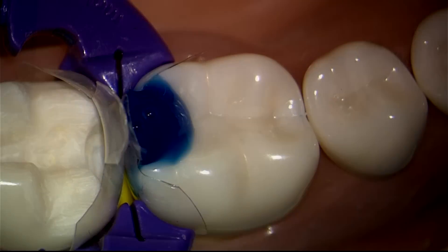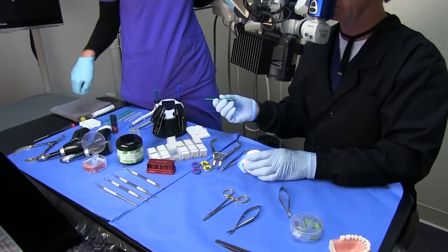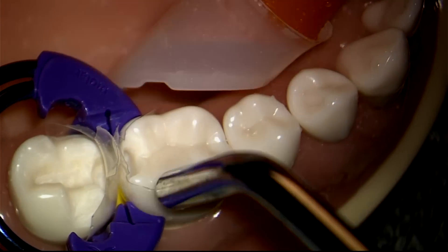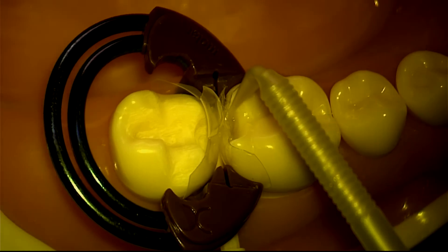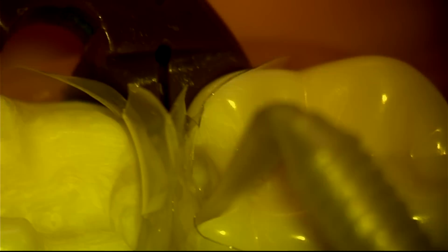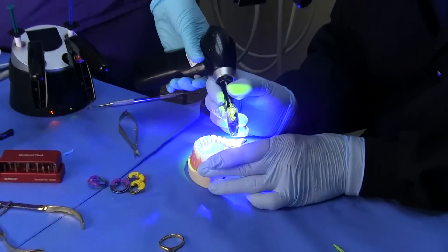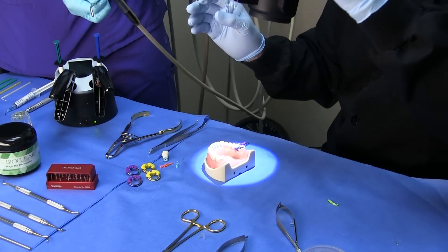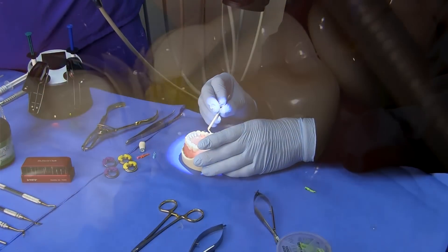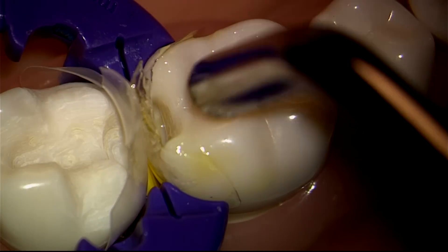Can I have a brush please? You can agitate this just to make sure we've got our infinity edge well etched. We're going to massage the Scotch Bond Universal adhesive into the dentin tubules for a full 20 seconds. Simply wet the area, air thin.